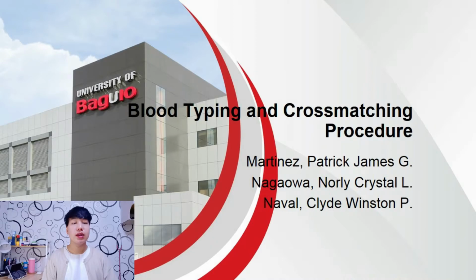So blood typing or ABO typing is done to detect the ABO incompatibility between a donor and a potential transfusion recipient. Therefore, it is the foundation on which all other pre-transfusion testing is based on. ABO typing is done using two types of tests. It can either be forward or reverse grouping.